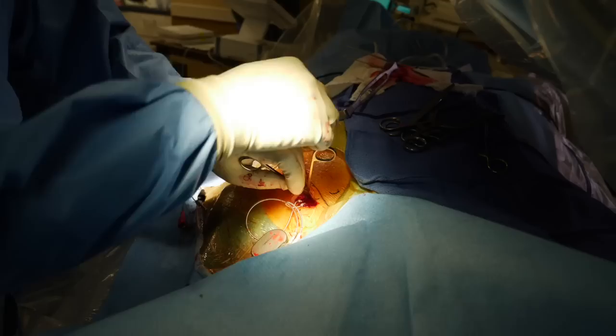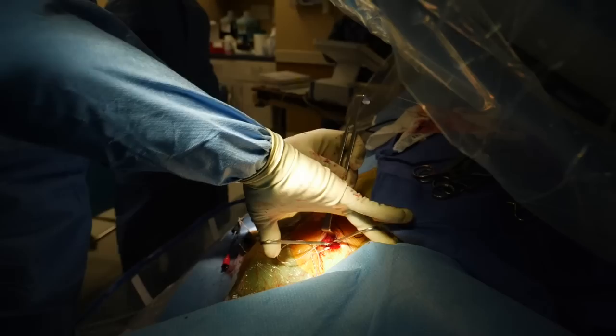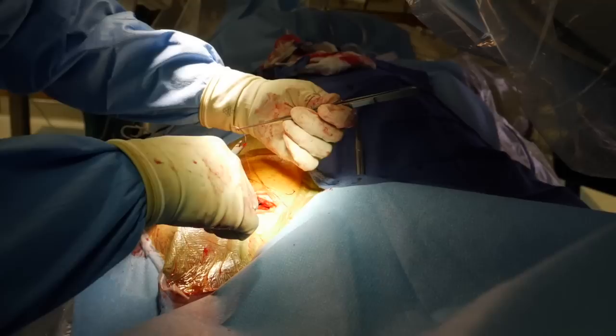This particular patient wanted us to go under the muscle with the pacemaker — we call that a submuscular pocket. After numbing it up, we create a tissue plane under the muscle fibers so the pacemaker can sit actually below the top layer of the chest muscle. There we are creating that extra pocket. The pacemaker is now inside and we are closing those chest muscle layers over top of the pacemaker so it is completely underneath the muscle.